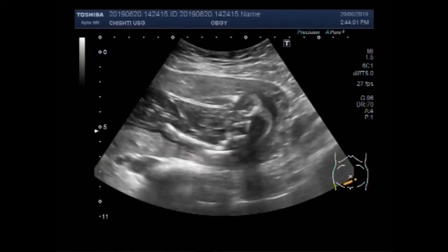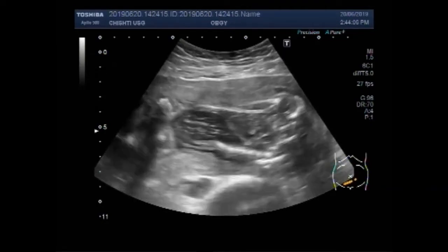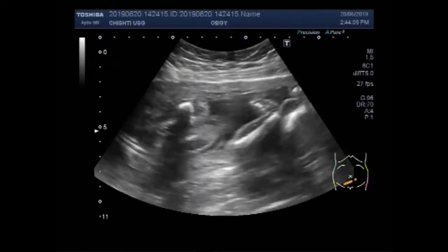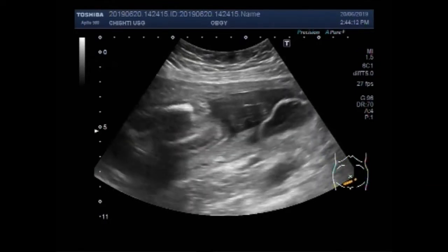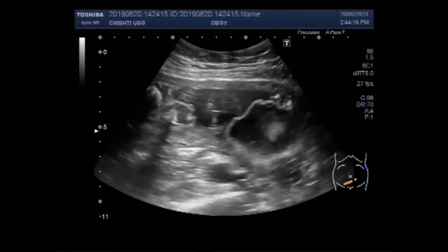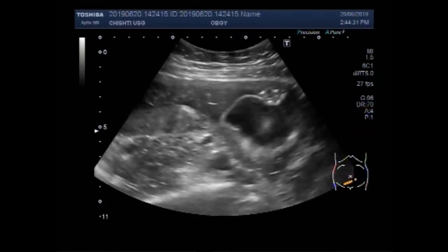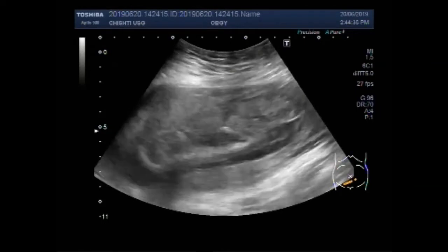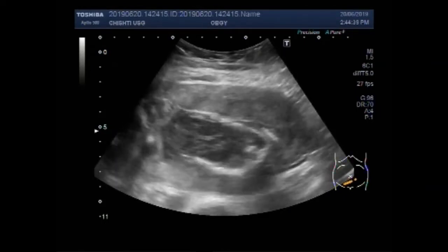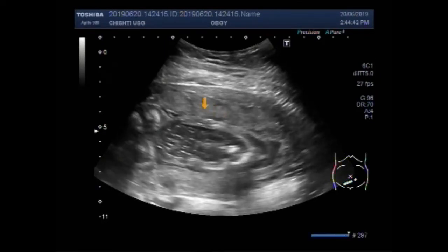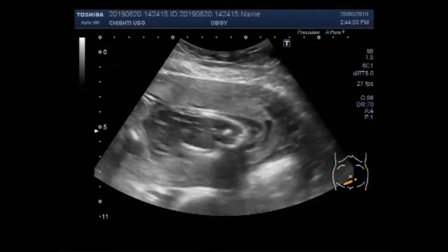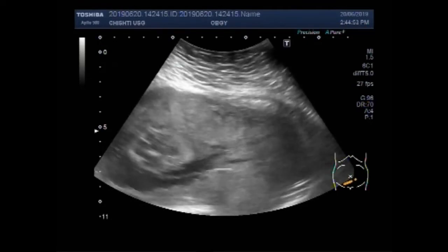Now you can see again the fetal abdominal cavity. And now you can see the encephalocele. This is the placenta. You can see there is no fetal movements.